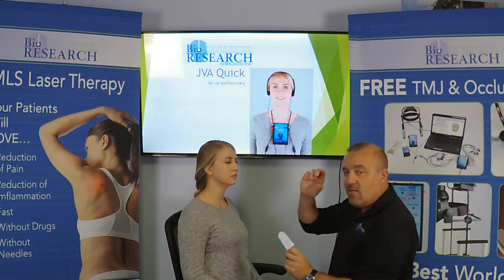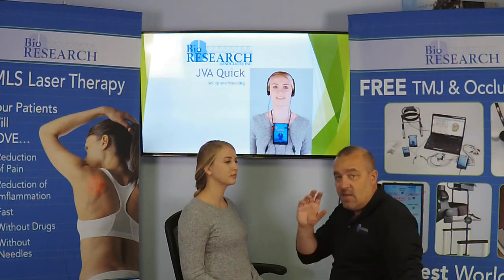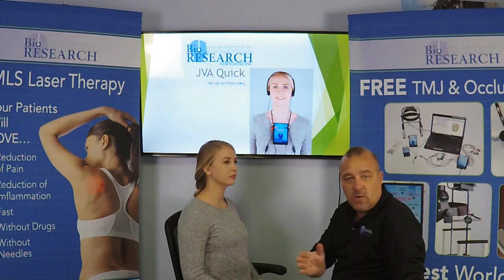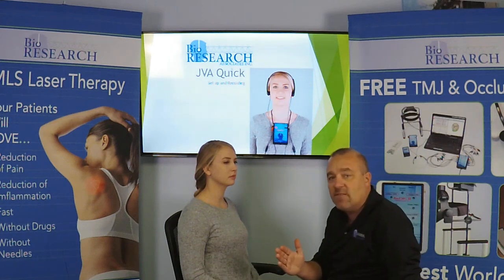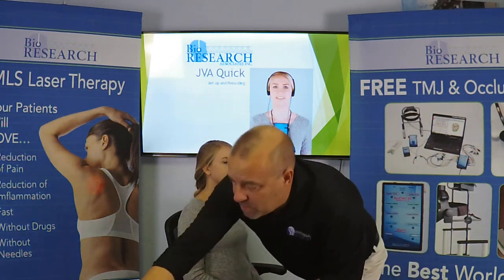But if they have a shorter range of motion, what you can do is take your range of motion card, hold it right along the midline, and have the patient open wide. Yeah, and she opens perfectly straight. So the lateral deflection, again, the position at maximum opening, for her is 0, but it could be some number of millimeters left and right. Unfortunately, without a jaw tracker, you have to estimate this number. So I'll put 0.